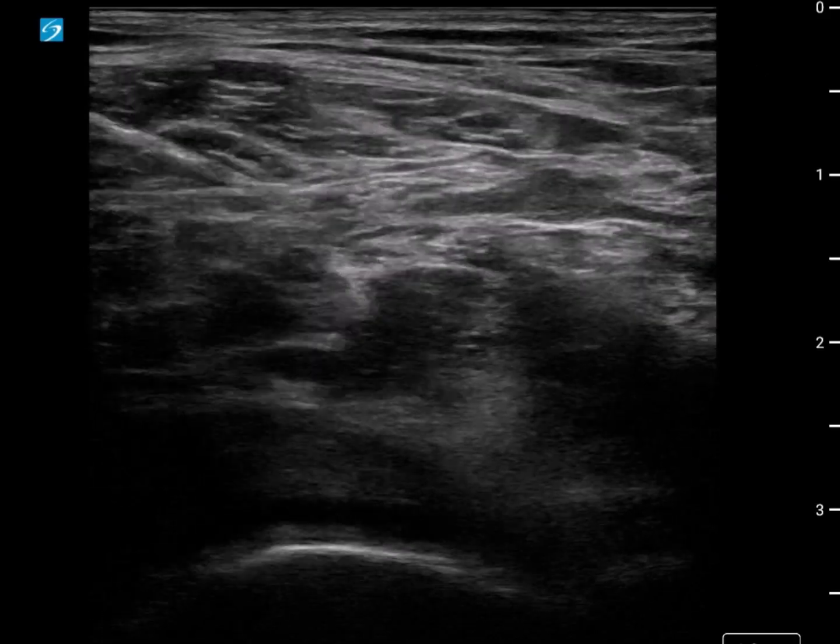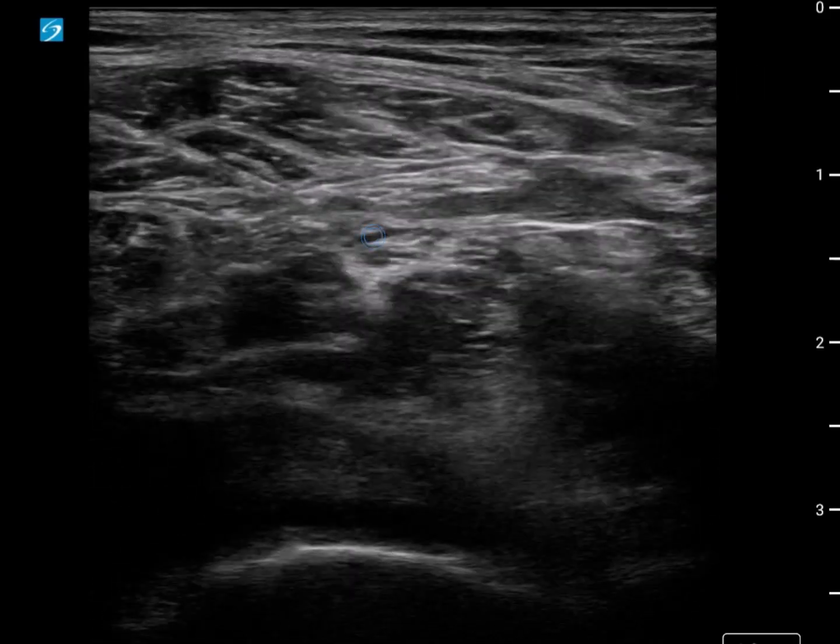A little flick. Now we've noticed here we've got a little bit of a pocket of local anesthetic that we're going to advance into. We still think we've got nerve out here, and then this is safe. Now this is a retrospective thing - have a look here. This is quite hyper-echoic, and there's a potential that this is nerve tissue, so this is one of the benefits of doing this on an awake patient.